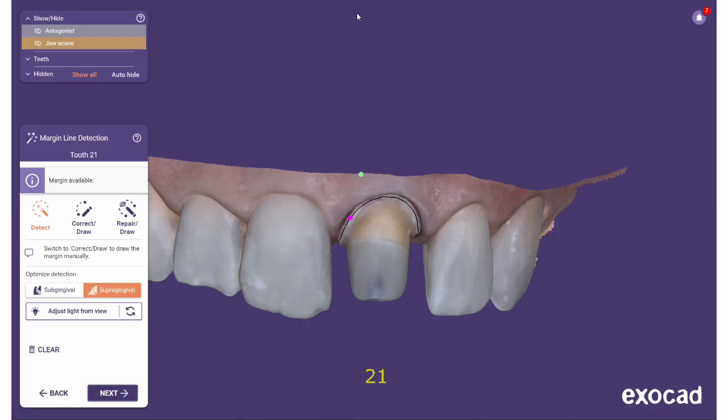This helps you find the correct position for the initial seed point for the automatic margin line detection. For crowns and related restorations, a single click will typically suffice. The automatic margin line detection will start after the first click. For inlays, four points must be set for the detection to start.